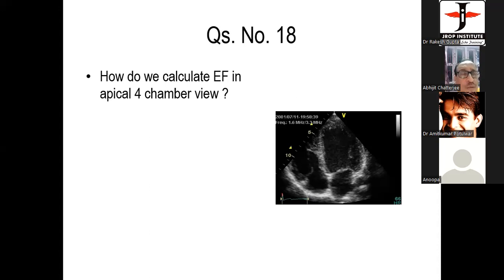Sir, no answer. You don't know. Please think and answer. Am I scaring you? Hello? Sir, clearly not audible, sir. Amit, his question is, how do you measure RV free wall systolic thickening by tissue Doppler? Not nonsense. All right. You know what? Any other question, Abhijit? You can ask him.